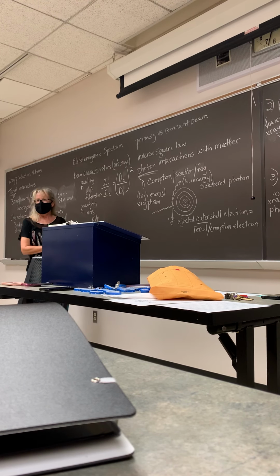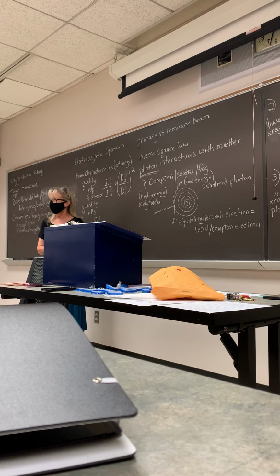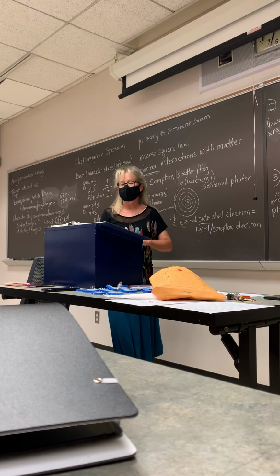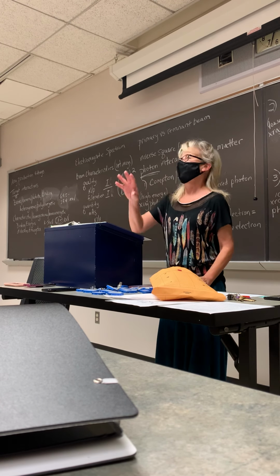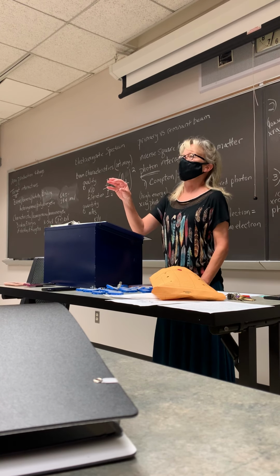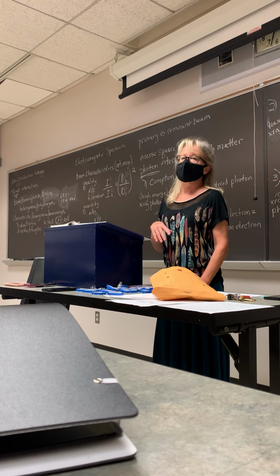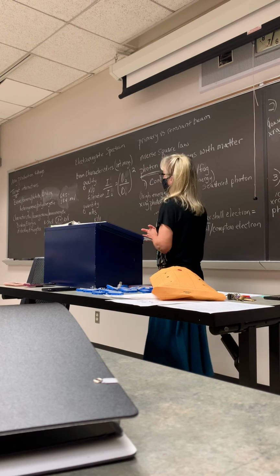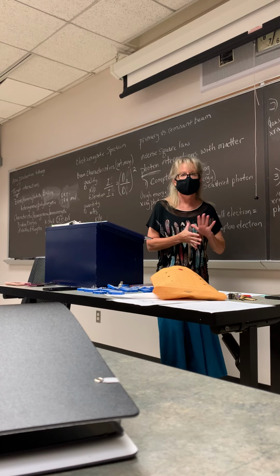All right, so are there electrons once it comes out of the tube? No electrons ever come out of the tube. Don't let the registry trick you. Sometimes they'll say, how many cathode ray electrons are produced and how much heat? There's no cathode ray electrons produced. All right, so we need a source of free electrons. How do we get that?